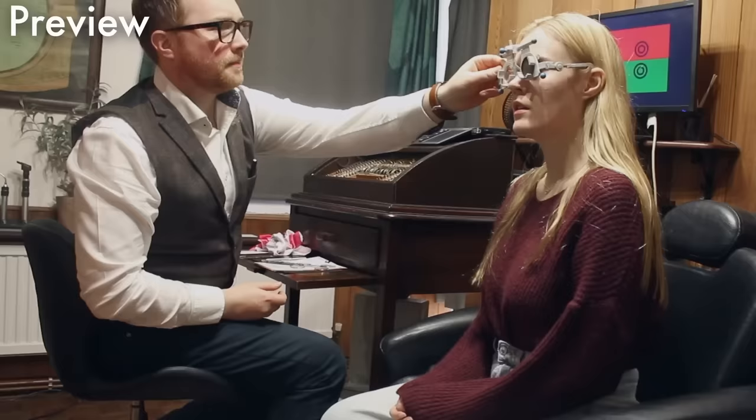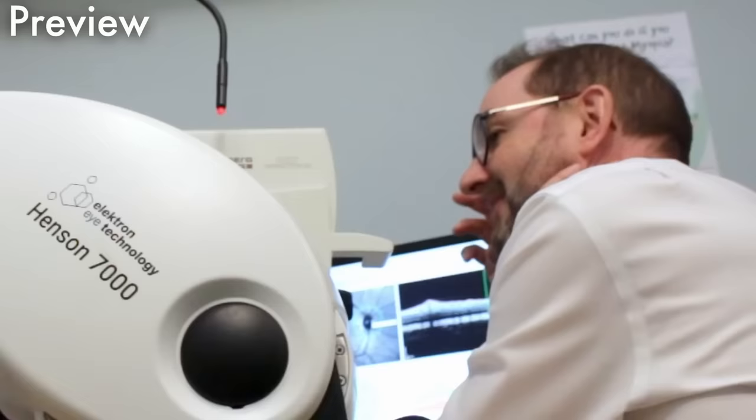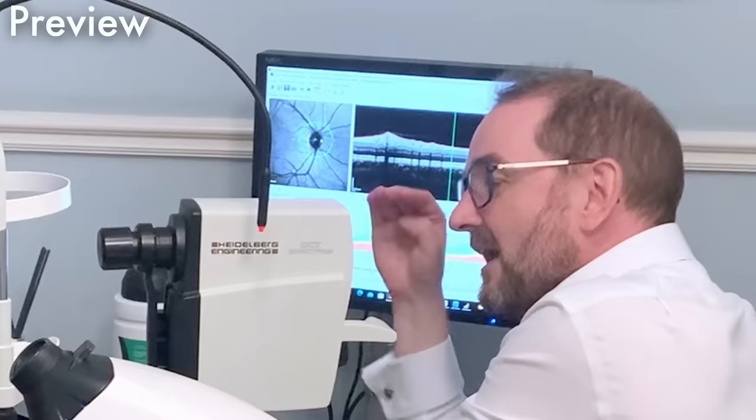And now the next thing I'm going to get you to do is to have a look at those two circles just there. So this is your optic nerve here. Well, the vessels go out the back of your eye. So it's really sharp, actually. It's a good image. Basically, with glaucoma, you have an increased pressure in the middle of your eye, and that causes damage to the optic nerve at the back of your eye. And it affects the thickness of the nerve fibre layer on your optic nerve. And if that thickness gets damaged and gets thinner, then you get a loss of visual field. So you start losing areas of your vision.